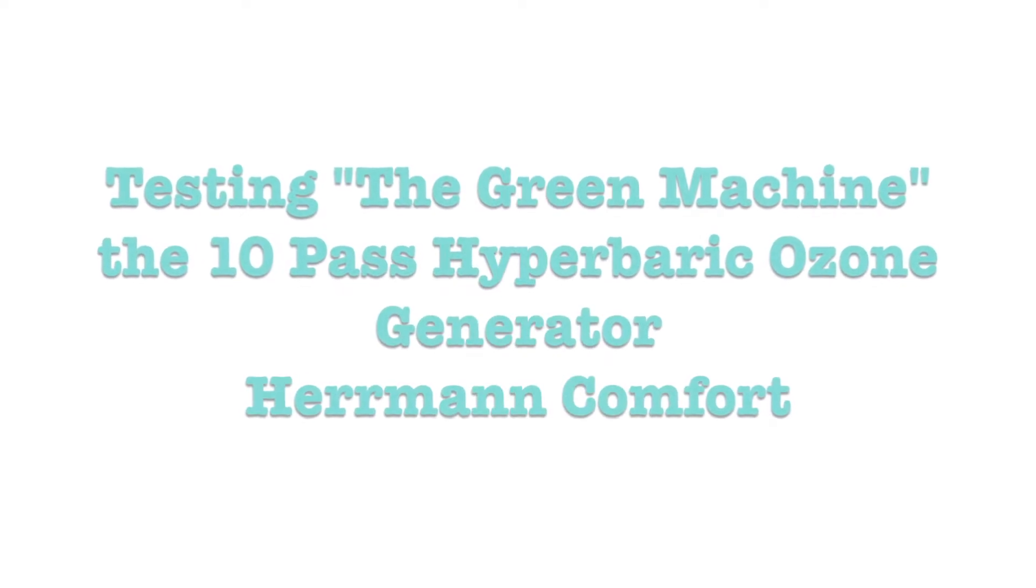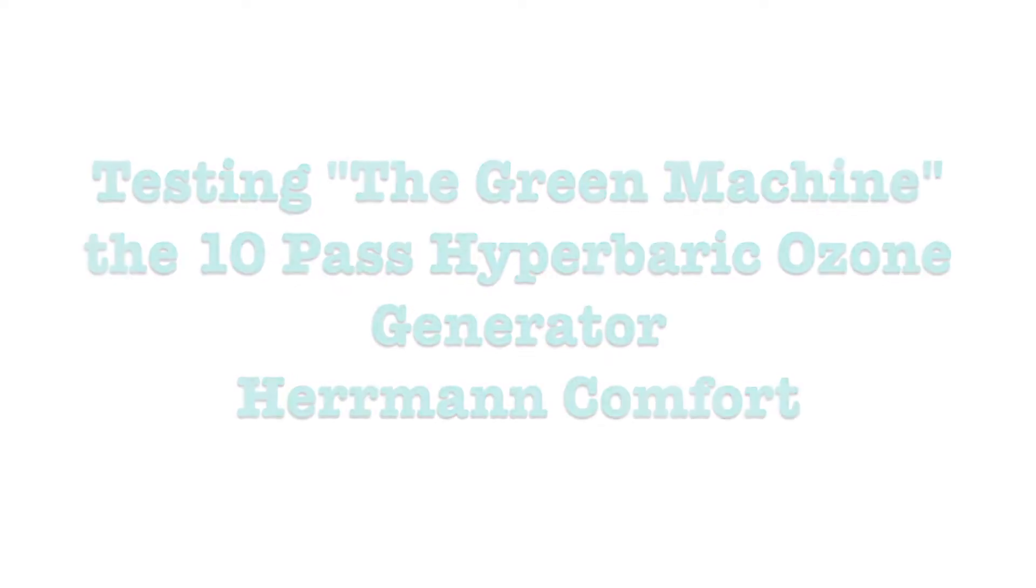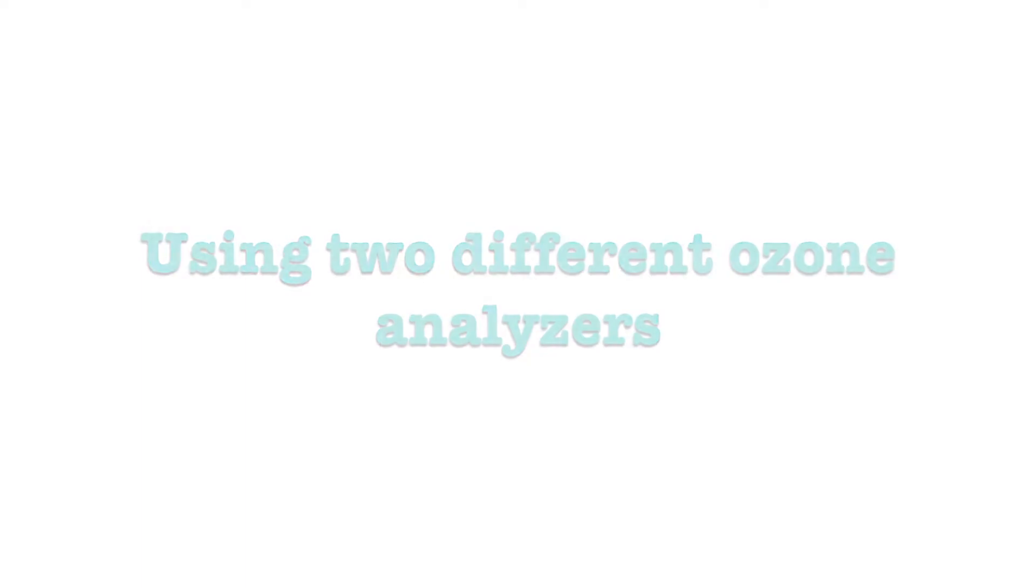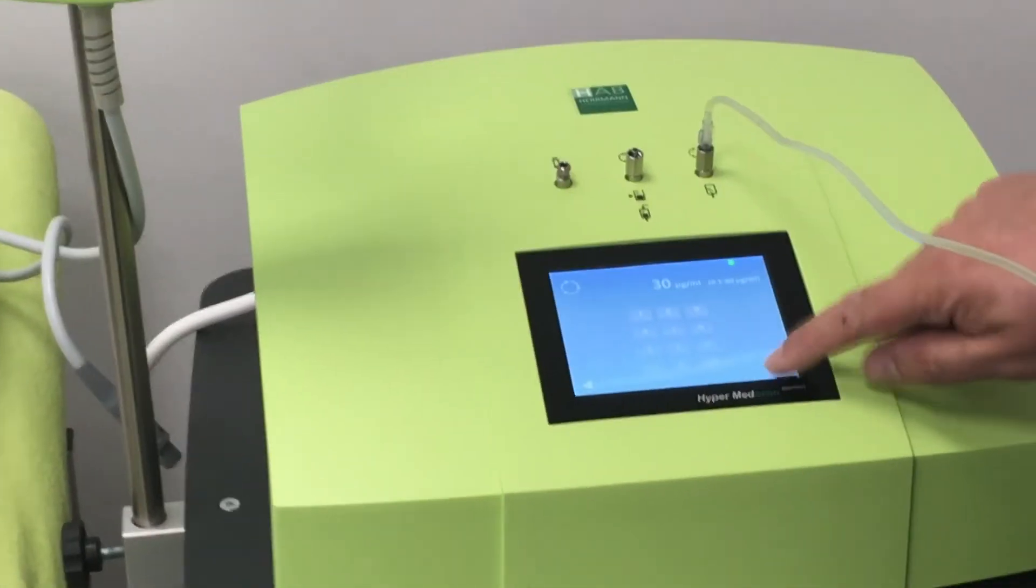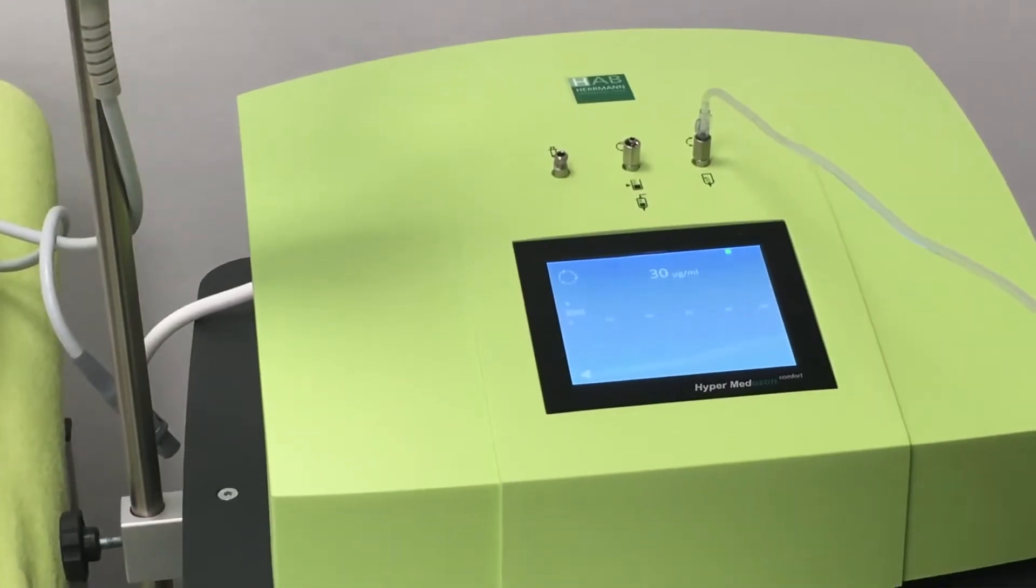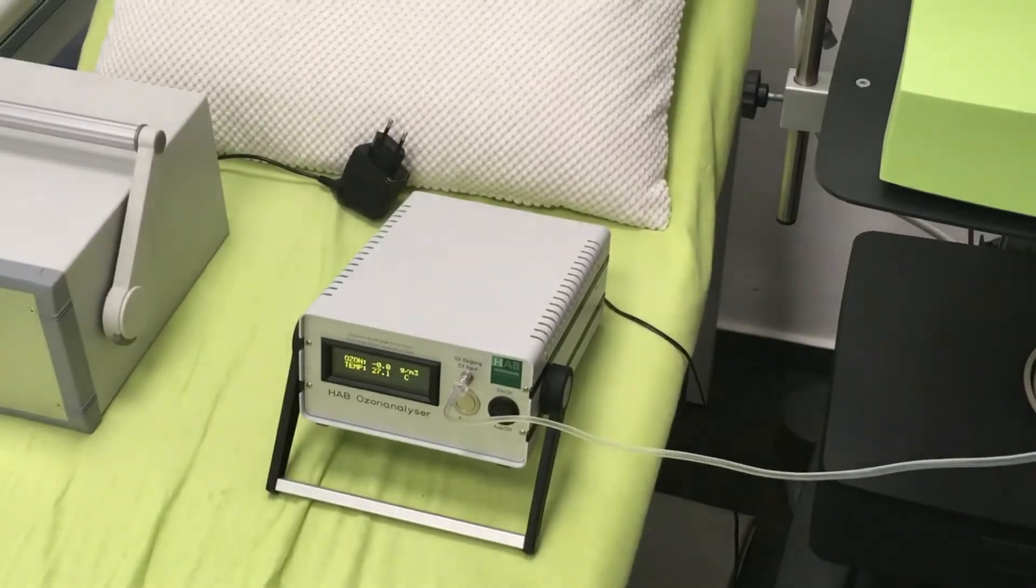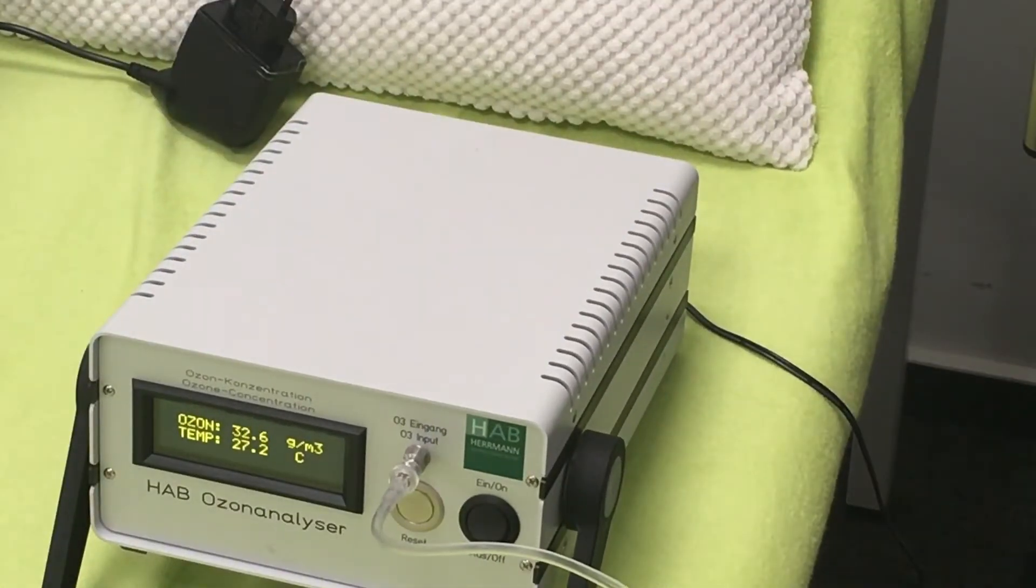Hi guys, here's Paula and in this video I'm going to show you the results of testing the Herrmann 10 Pass machine. The Herrmann company claims that their generators are accurate down to 1 to 2 micrograms per milliliter.